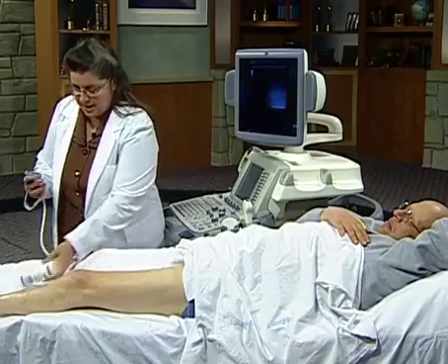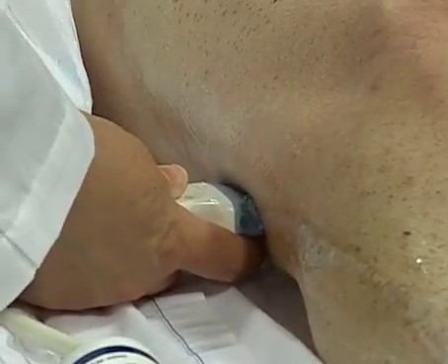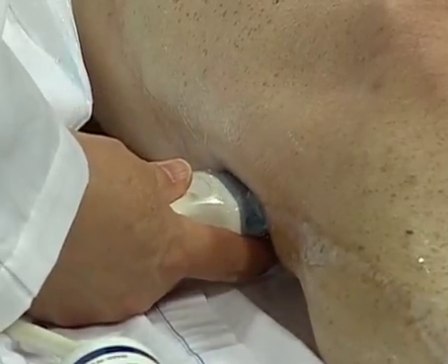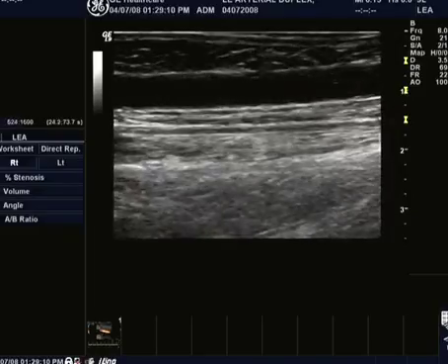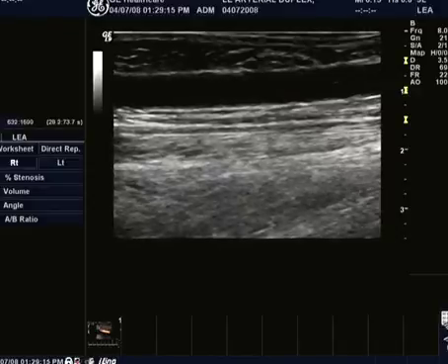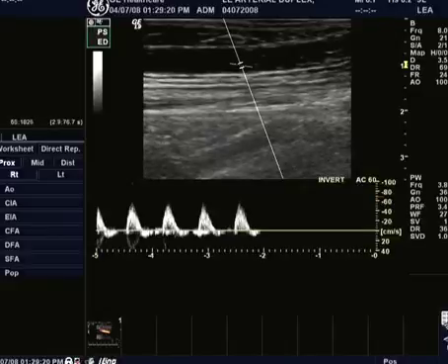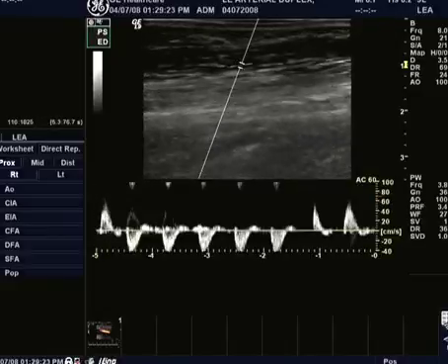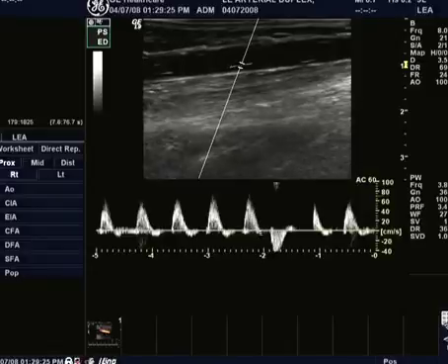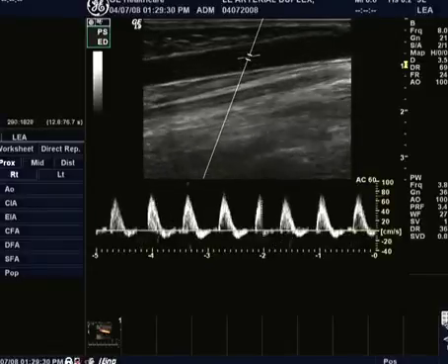We're coming down to the knee. Sometimes, depending upon the position of the bypass graft, in his case, it doesn't run too posterior. So I can see things pretty well here, and I can fit in the transducer just fine. You can see where my hand is. If it were a little more posterior, I would have him bend his knee a little bit and rotate his leg out a little bit, but it's pretty good so far. And again, maybe in through here, I'll switch back and angle the other way, working with the natural curves of that bypass in his leg.